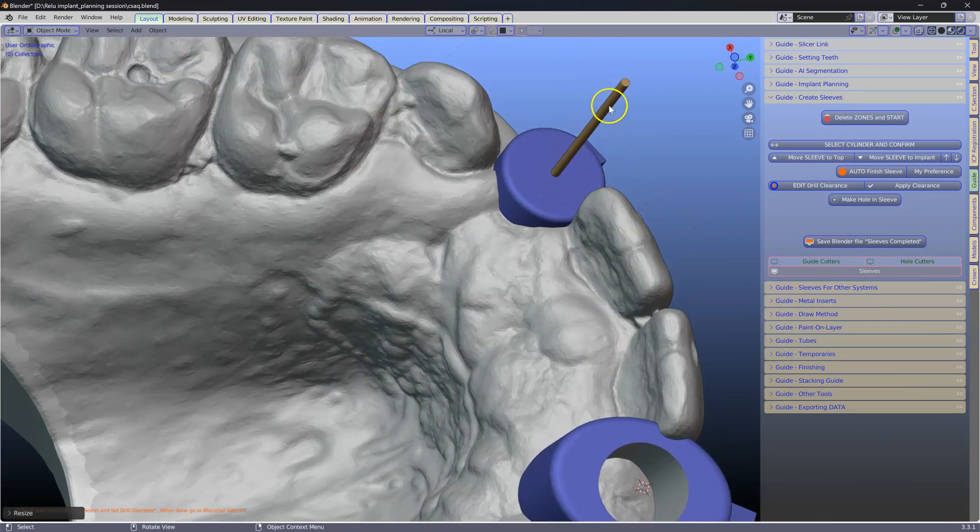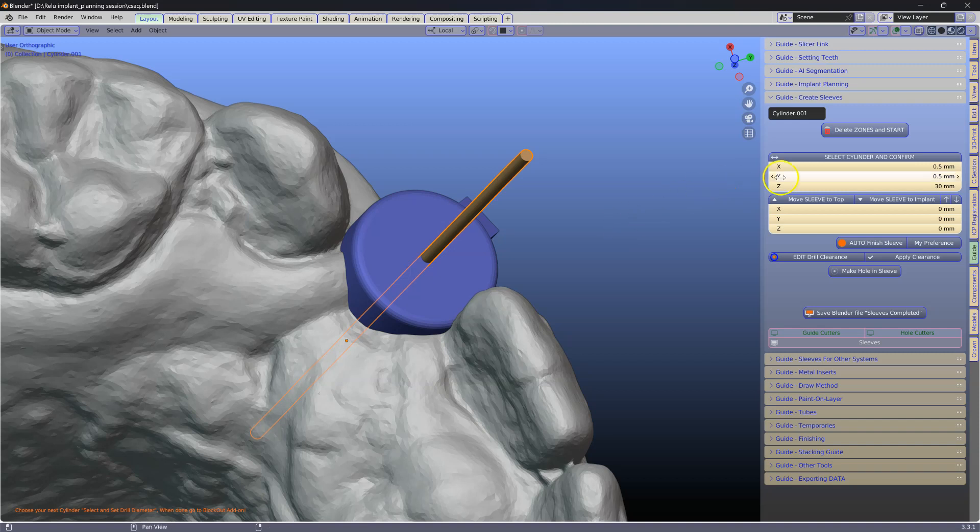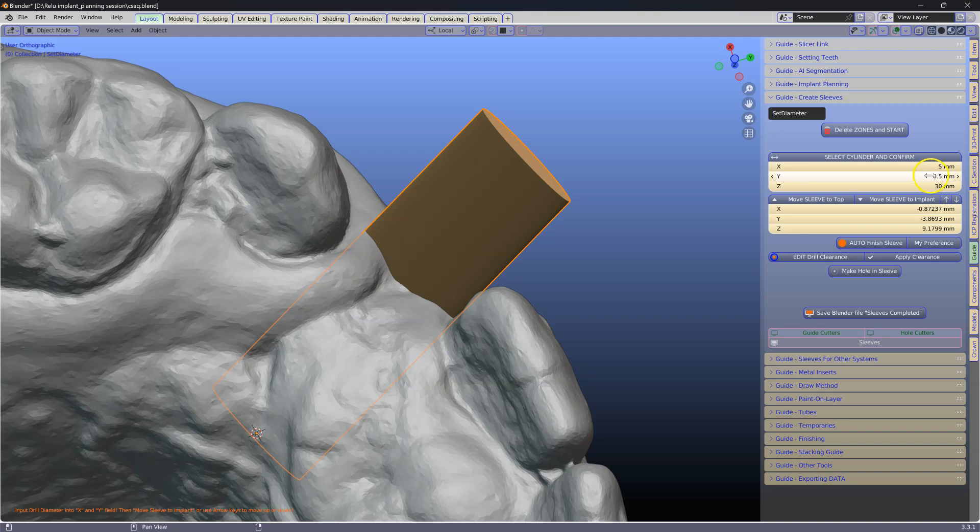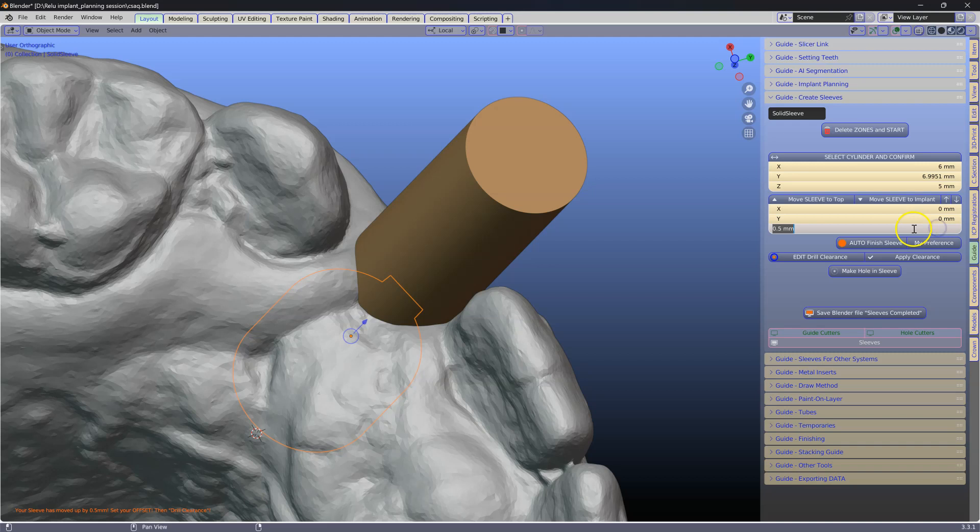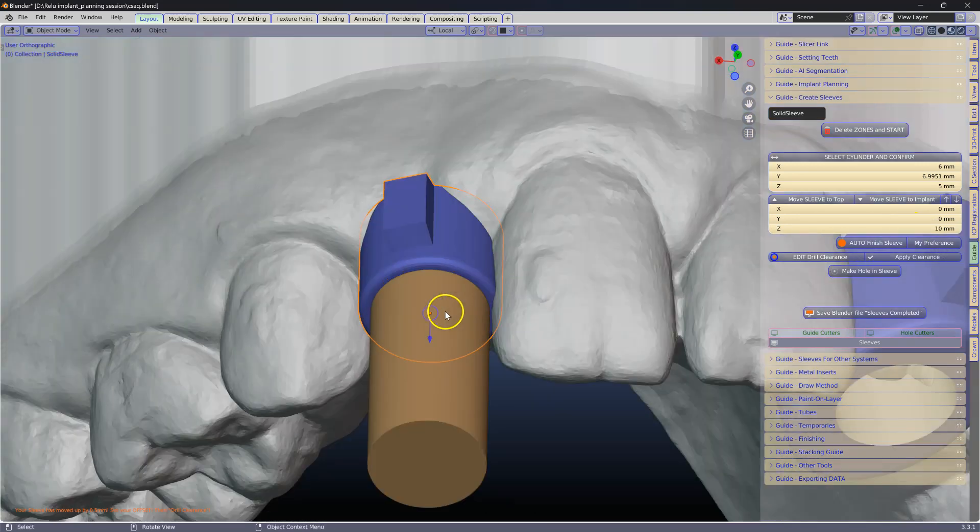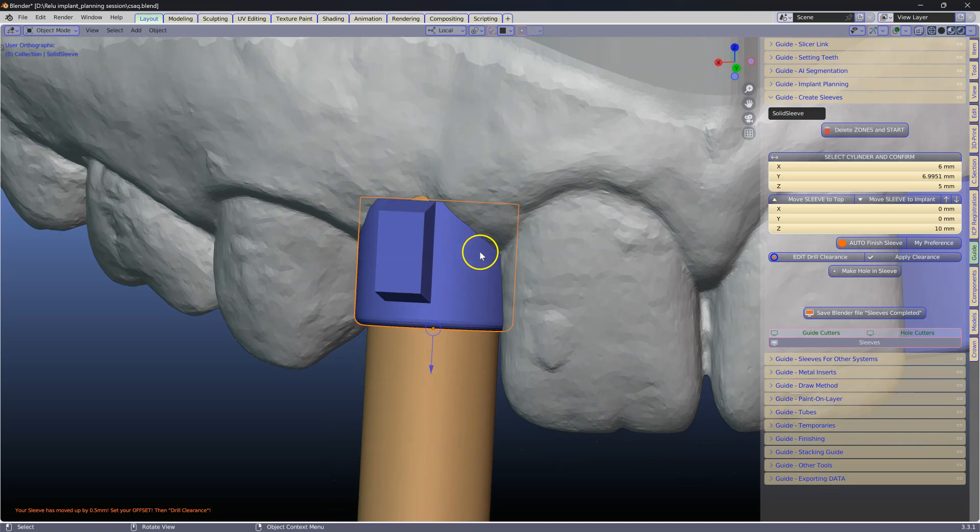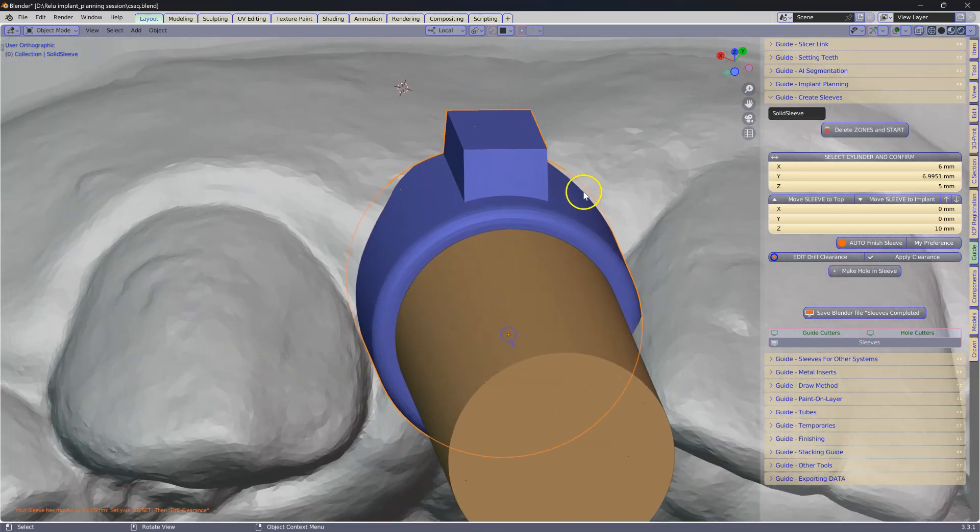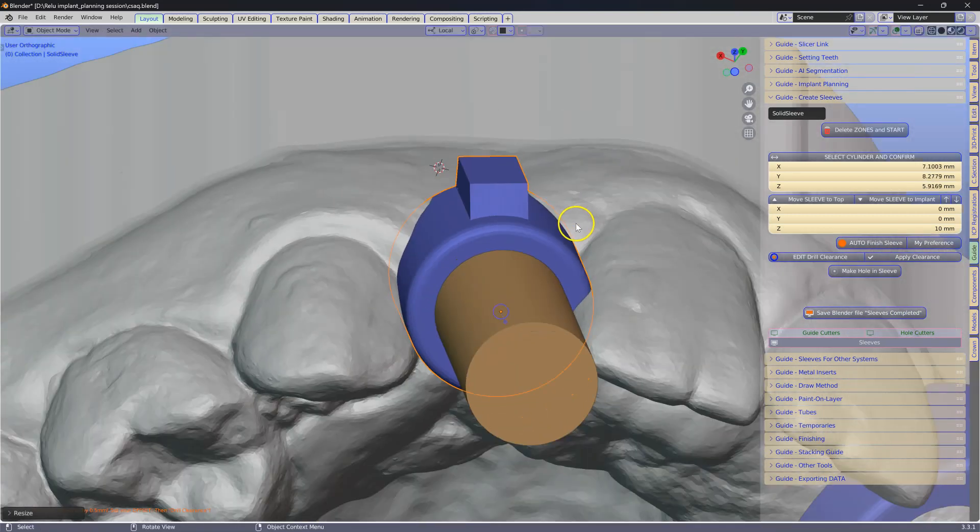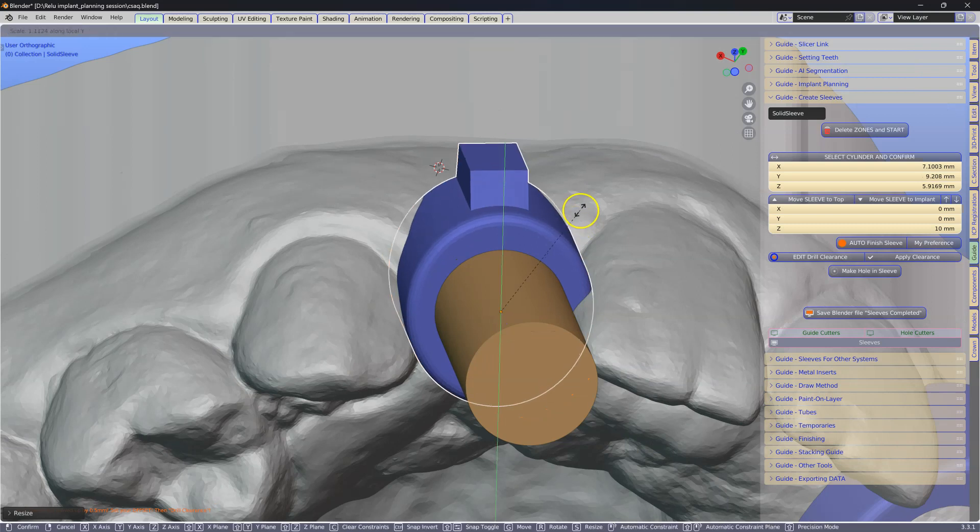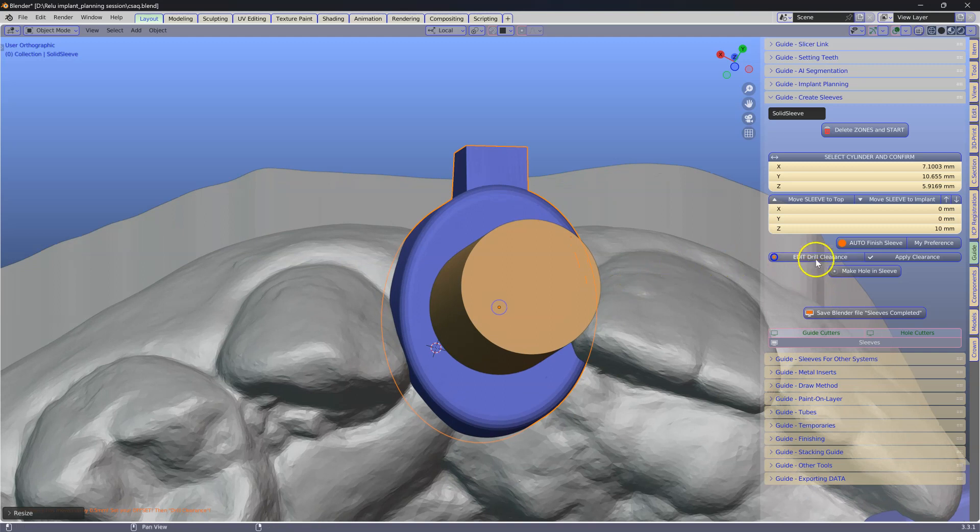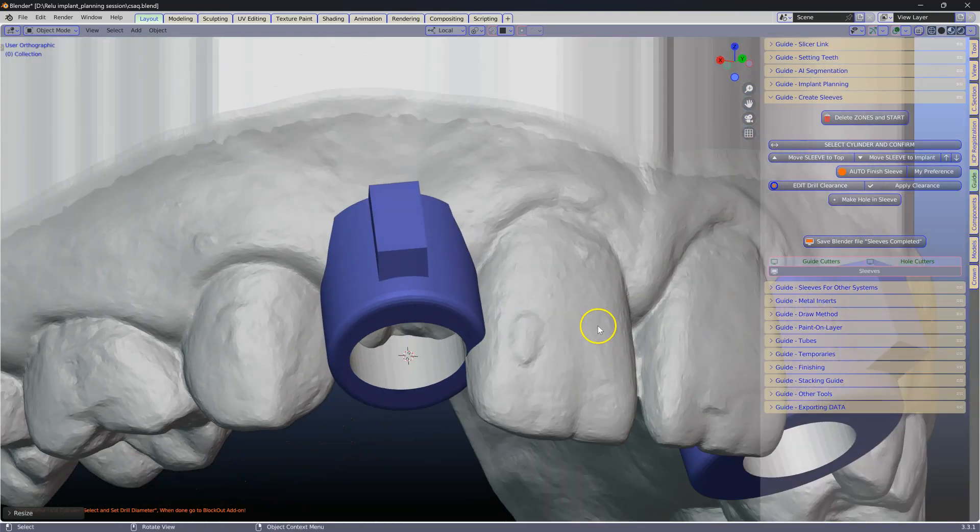With this one we are going to do the more automatic way of doing it. Same thing. Key in your diameter. We are going to set this at 10 as before. And I am going to scale this up because this sleeve is too thin. Then S to scale and SY to make it a bit longer. Then we are going to auto finish sleeve which is going to punch a hole straight through it.